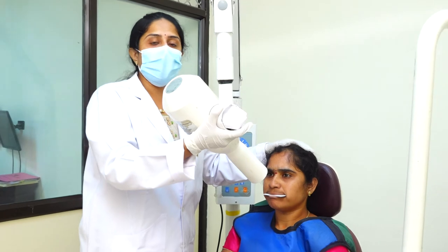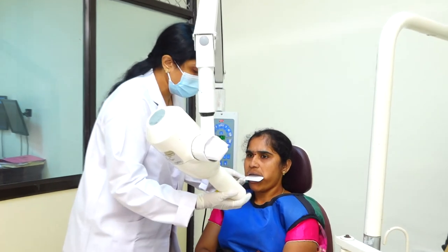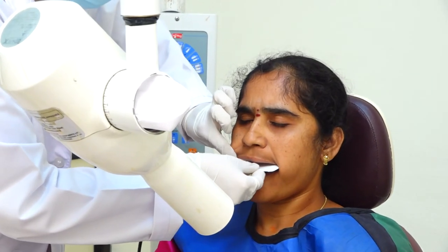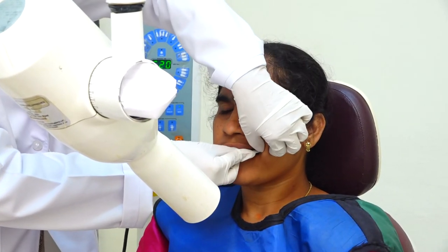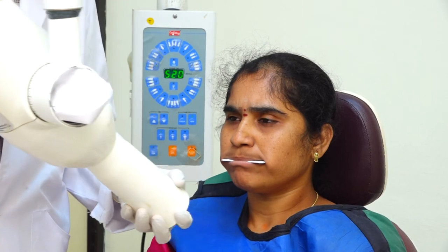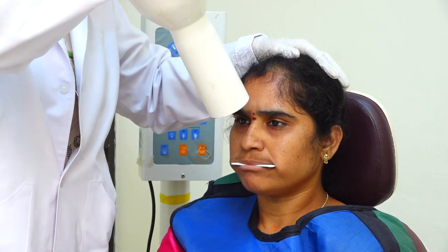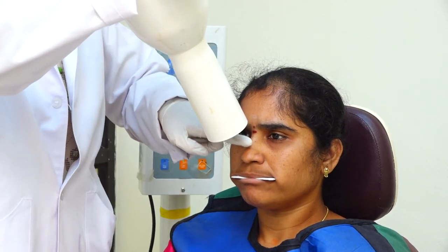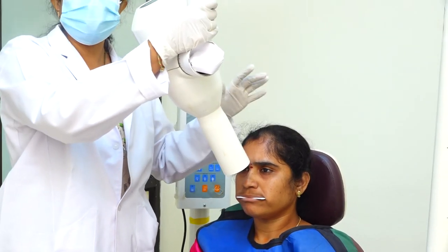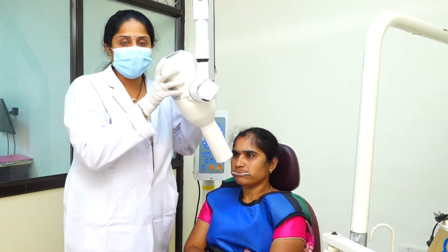Let's have a look at the maxillary cross-sectional or topographic radiograph. Here, we will place the occlusal film a bit posterior so that it covers the entire arch. Ask the patient to bite on the film and change the angulation to plus 65 degrees. The central ray should pass through the bridge of the nose — that is, just below the nasion — so that it covers the entire maxillary arch from molar to molar.